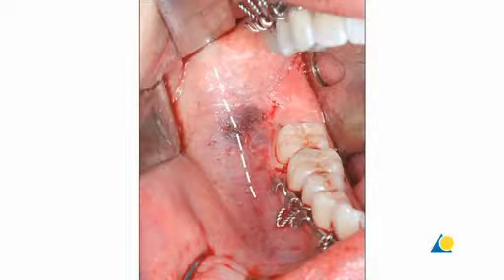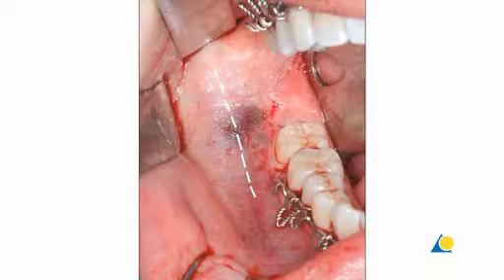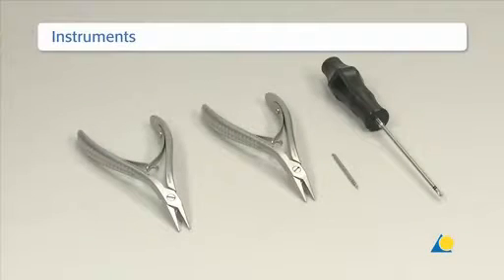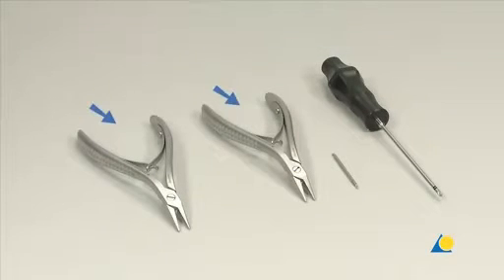If there is no erupted molar to be removed, or there is a fully impacted molar in the fracture, an incision along the external oblique ridge is made. If there is an erupted molar that will be removed during surgery, the mucosal incision should be made so that closure over the extraction site is facilitated after fixation of the fracture. The instruments needed are 2 bending pliers, the 1.5 mm drill bit with 6 mm stop, and a self-holding screwdriver.